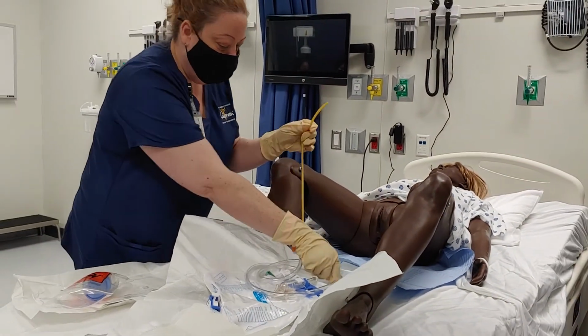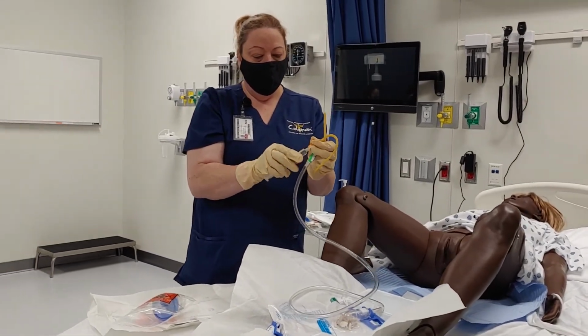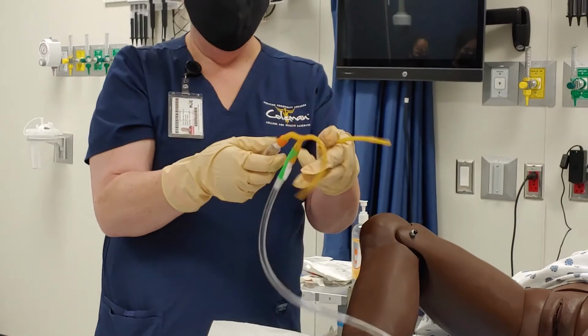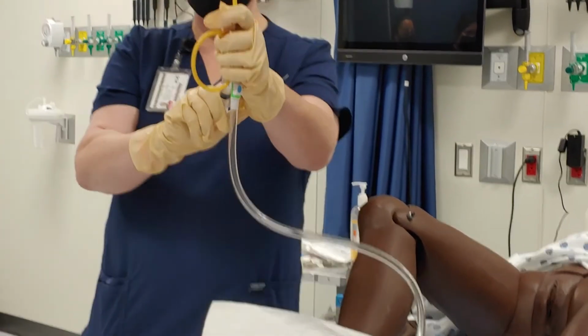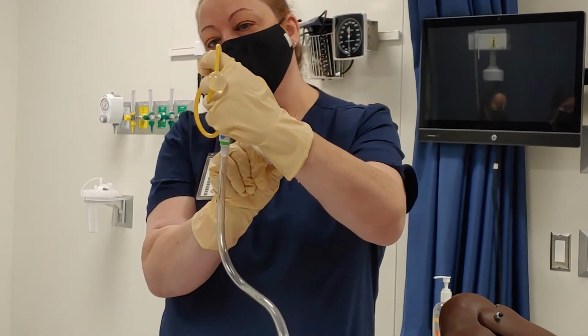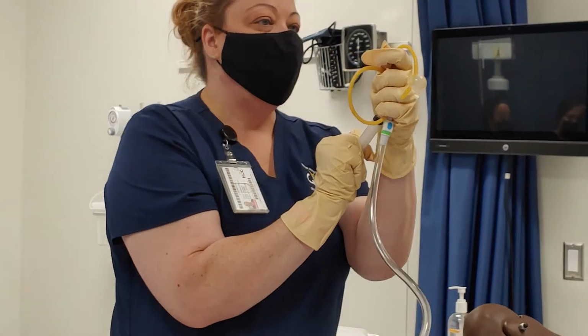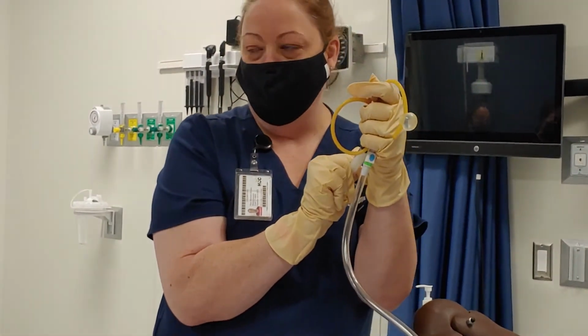Now, I want to show you what it looks like when we inflate the balloon. Okay, so that's a full balloon. So that's going to keep it from coming out inadvertently.